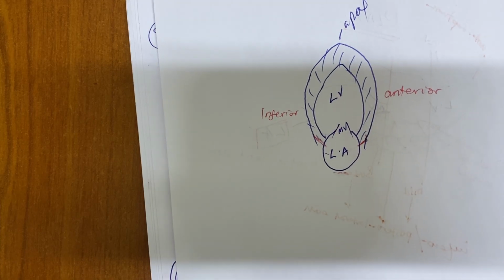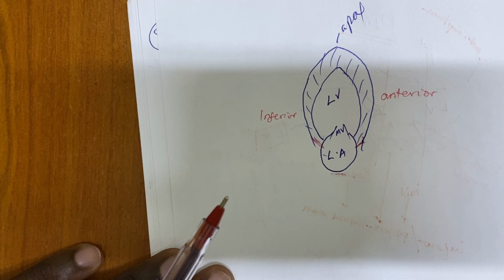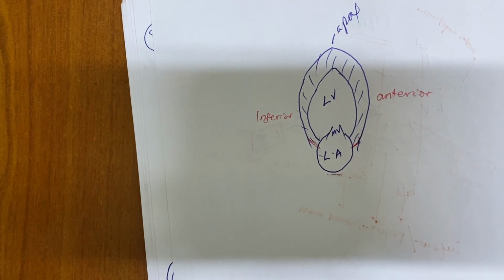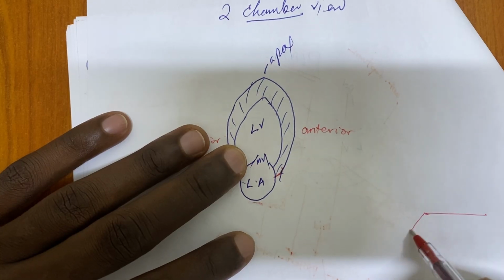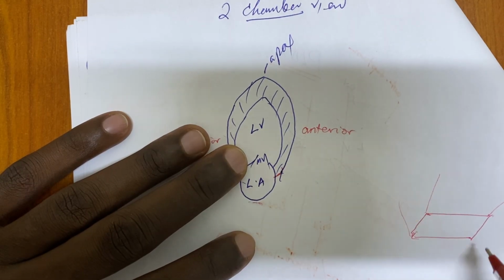But now, how do we orient this for apical two chamber? The probe marker is pointing to the left, but not all the way. You have to rotate it a bit, with some rotation and tilting, so that you get images. If this is the probe marker footprint, meaning the beam will come out like that, and it's long like that.